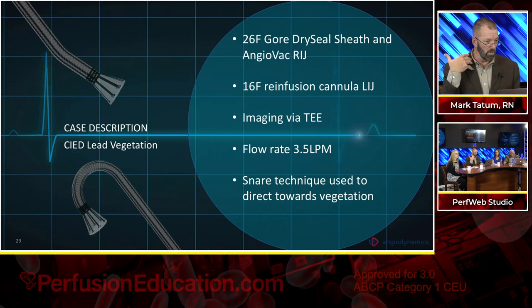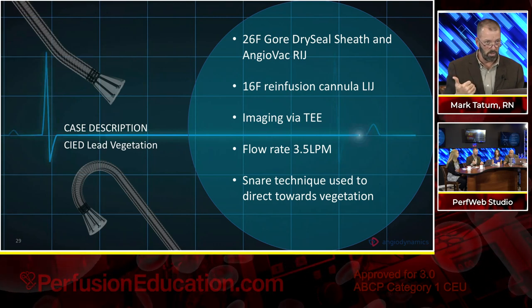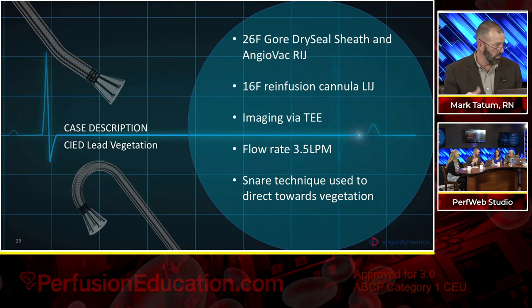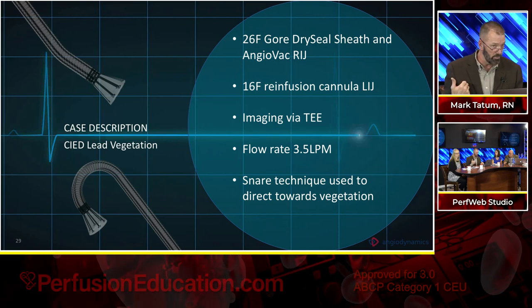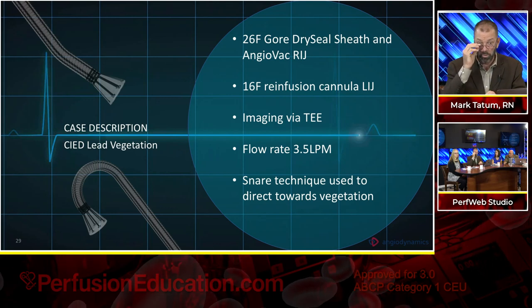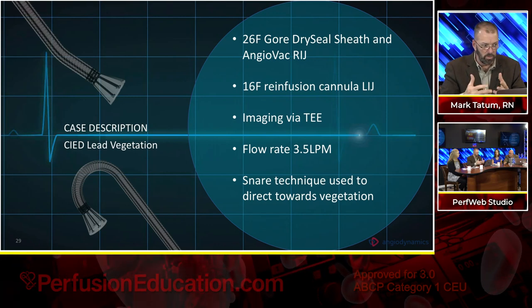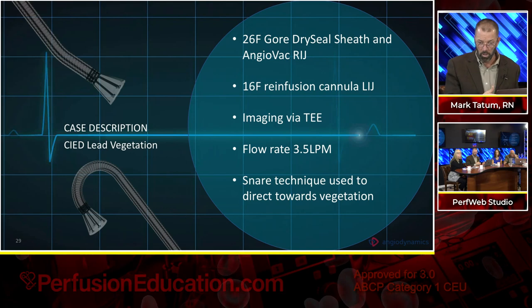So if their initial approach is IJ or femoral, for a septal leaflet it may not get there as well as it would from an IJ approach, as an example. Or an anterior leaflet from the IJ may not get there as well as it would from the femoral approach. None of us on our team are going to dictate medical practice. What we are going to do is share our best experiences with the physicians so they have more information to draw from.